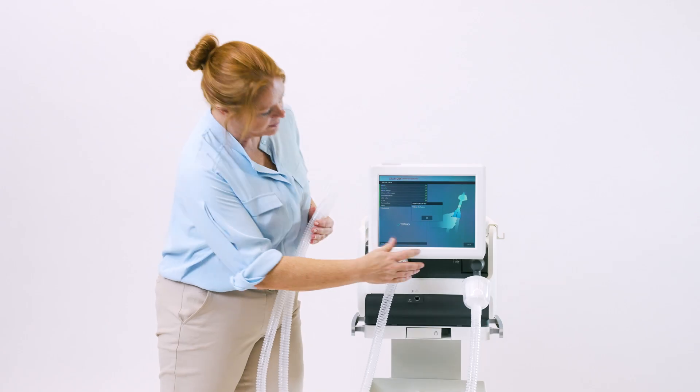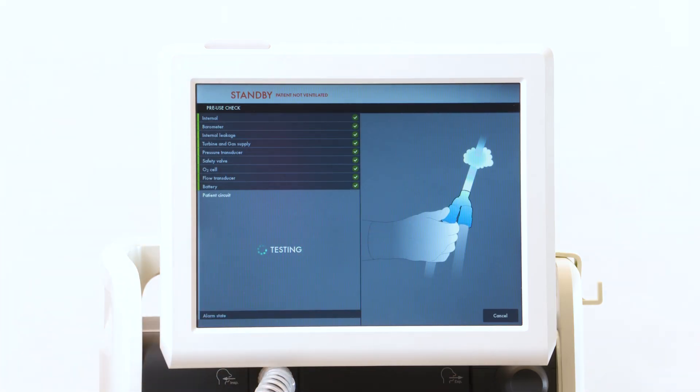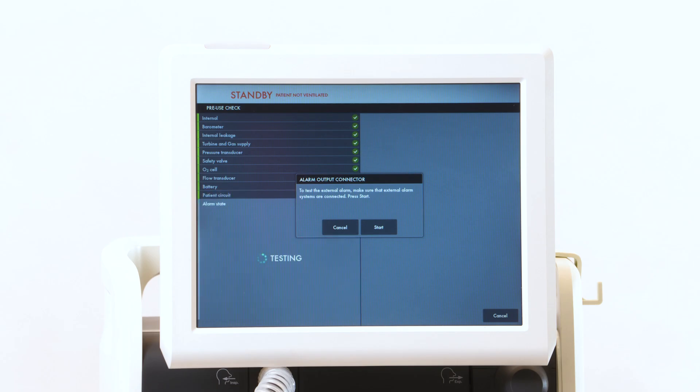Unblock the tube and press OK. Your pre-use check is then complete.